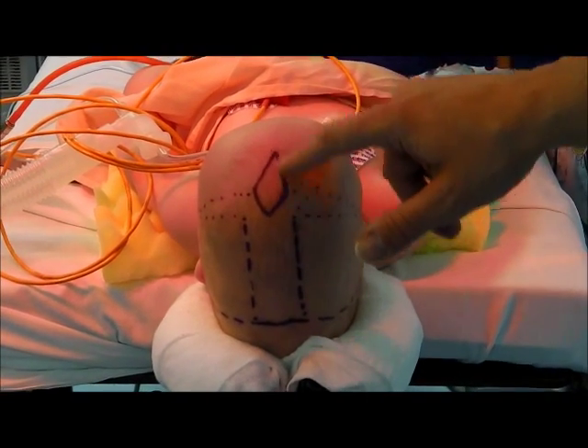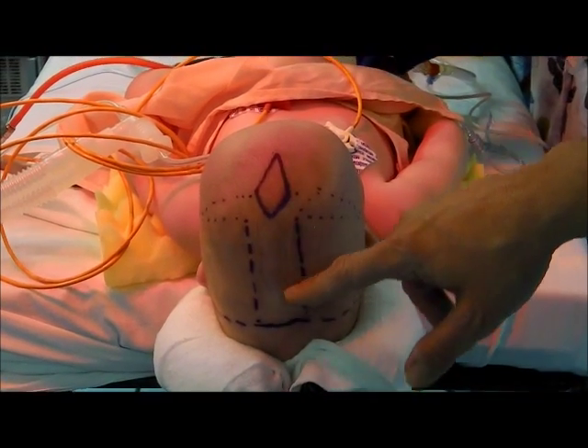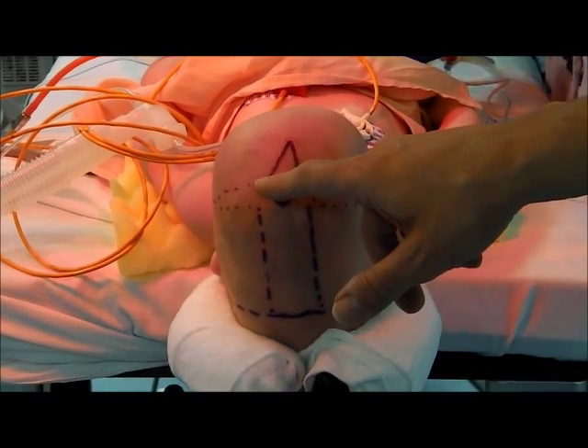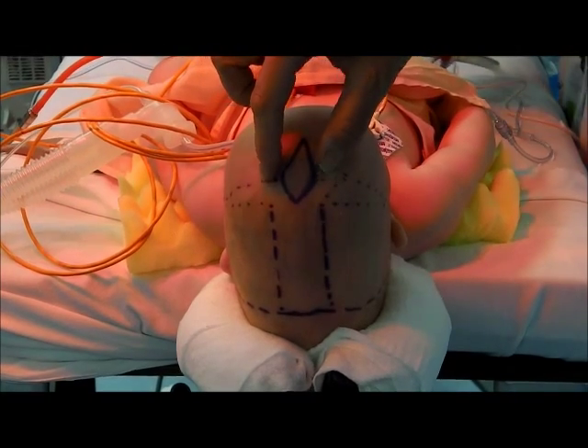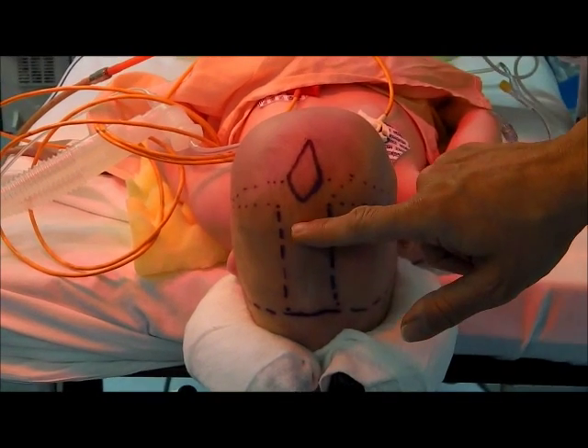I've drawn out the shape of the fontanel here. Today we're going to be taking out the part of the bone that contains the prematurely fused sagittal suture. We'll be making a small incision on the baby's head from here to here, and then going underneath the skin to remove this piece of bone right here.